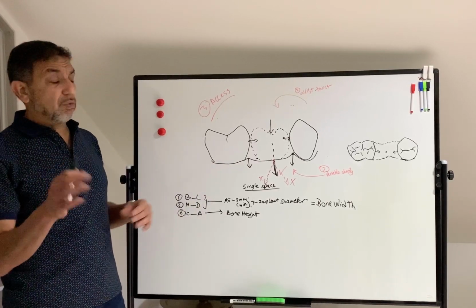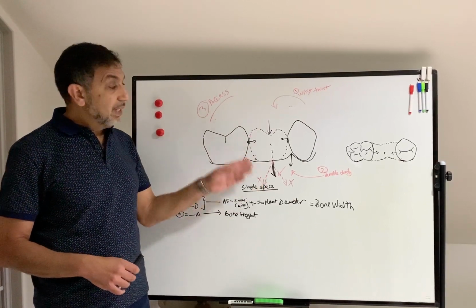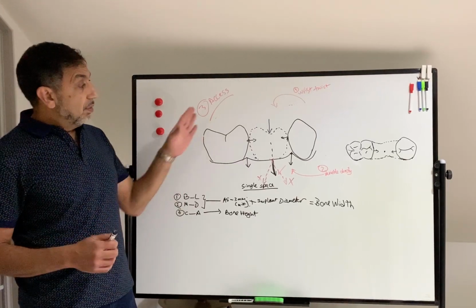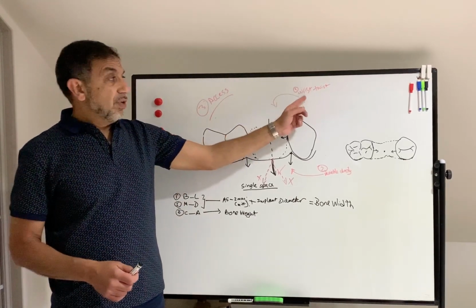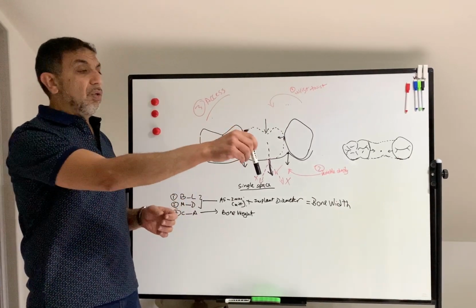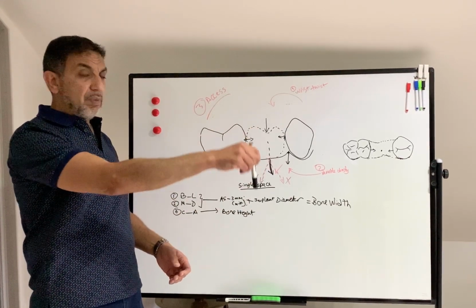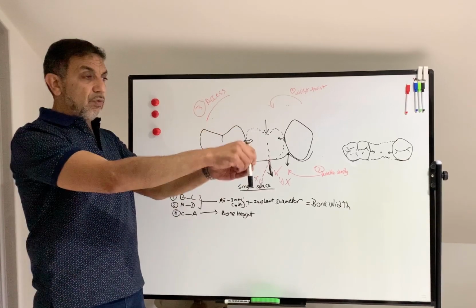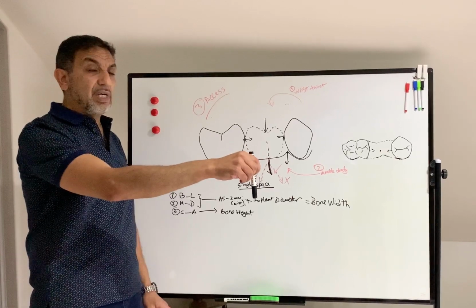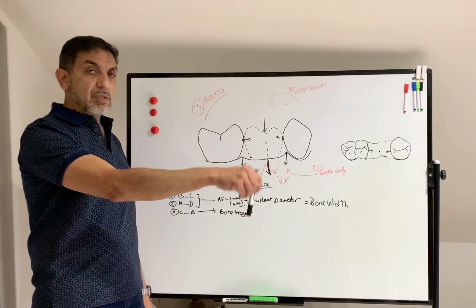Let's just talk first about what causes positional problems when you're placing an implant in a single bounded space like this. First of all, there are three reasons. One of them is the wrist twist. The wrist twist means that you're holding your handpiece with the drill, and then you're trying to drill the osteotomy hole, but instead of going straight like this, you're using the handpiece as if you're drilling a cavity or a crown prep. So your wrist twists.